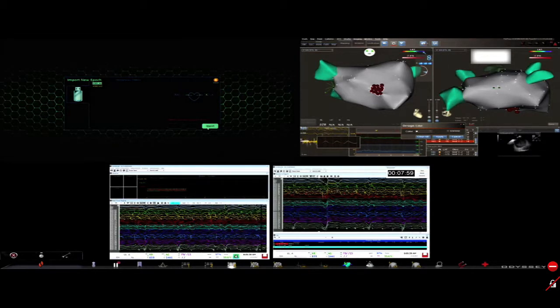And what size area are you planning to cover based on the information from the rotational activity that you observed? Is it about half a centimeter by a centimeter? Yeah, this is about, our average is typically for that.